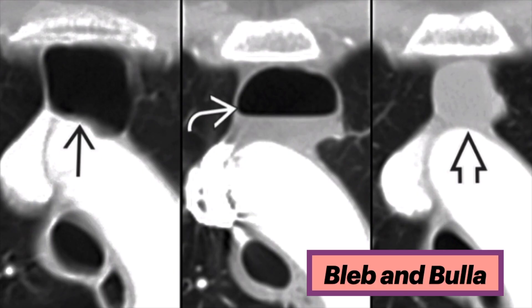Here is a composite image with axial contrast-enhanced CT of a patient with a left upper lobe bullae, which became secondarily infected. There is a thin-walled retrosternal bullae completely filled with air. Subsequent studies show an internal air-fluid level within the bullae that progressed to a completely fluid-filled bullae secondary to infection.